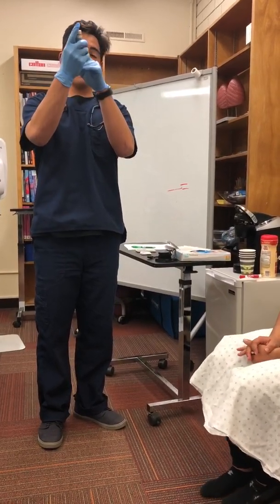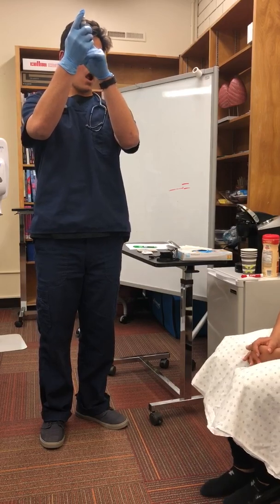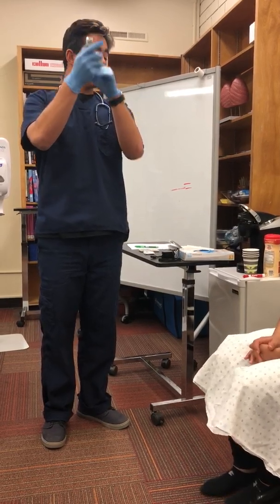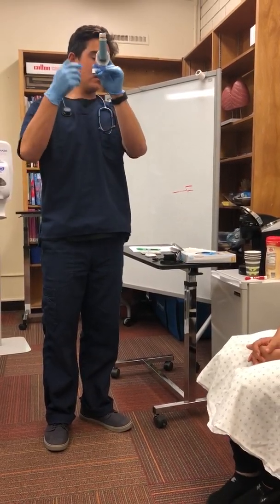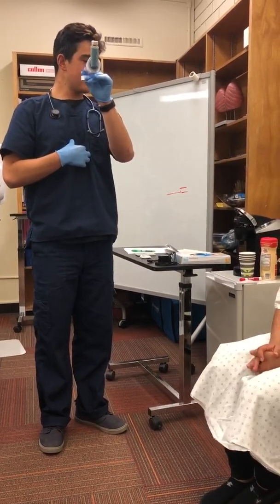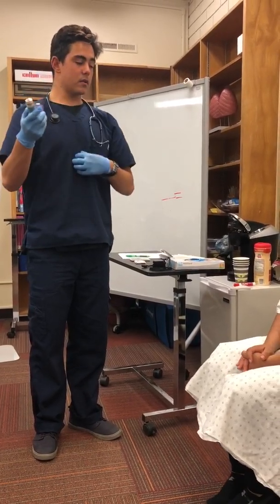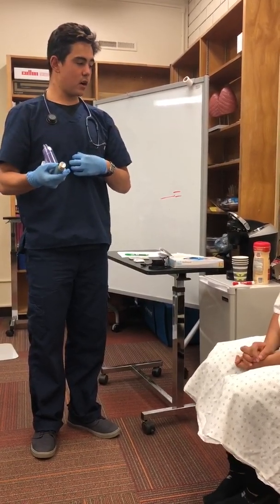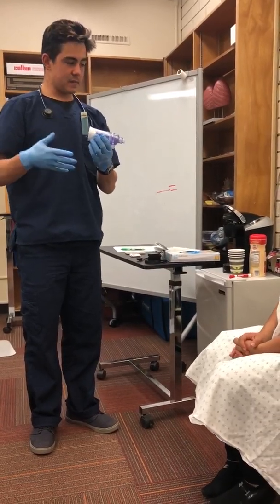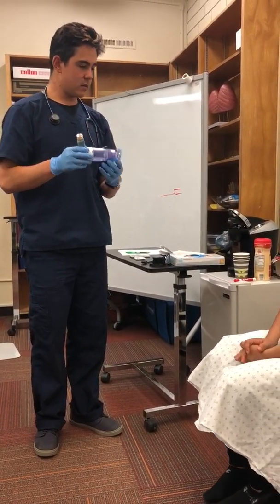So we're going to hold it in our mouth, take a big exhale out, and then hold it. Long inhale, we want a slow, long inhale. We're going to stop, and we want to hold for 4 to 10 seconds, 10 being the best, okay? Just to make sure everything deposits in our lungs. And then we're going to slowly exhale through our nose if possible, making sure that anything that's still in suspension in our airways can then deposit and we don't blow it out immediately. Do you have any questions about that?